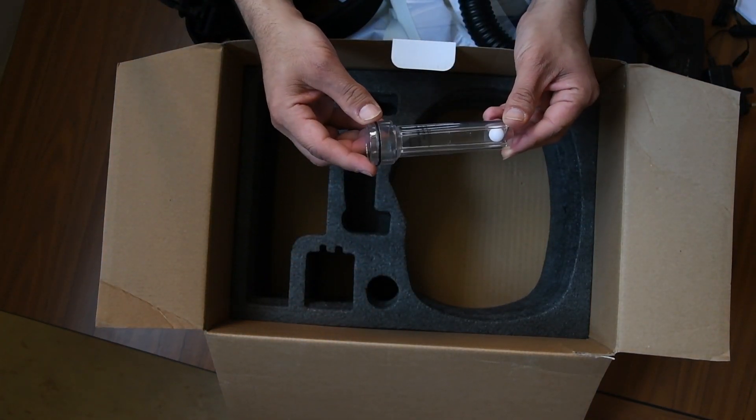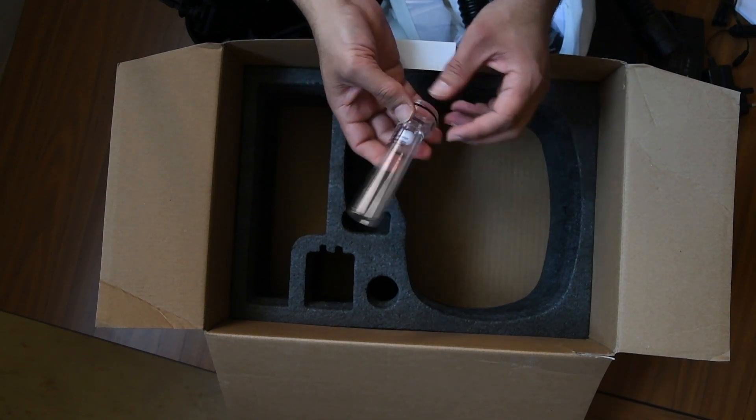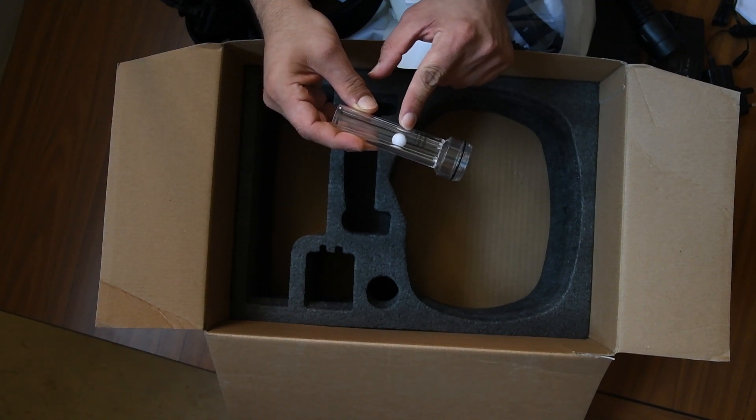An important part is the airflow tester. You can see there's a little marble, and there is a marking to show when you get the right airflow.